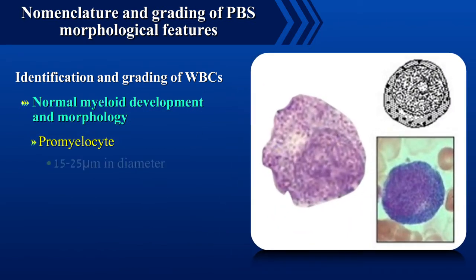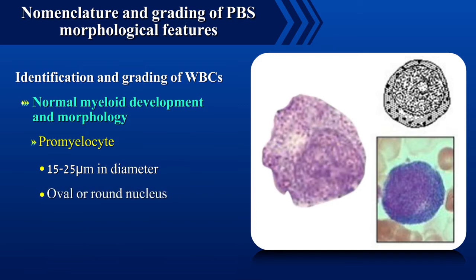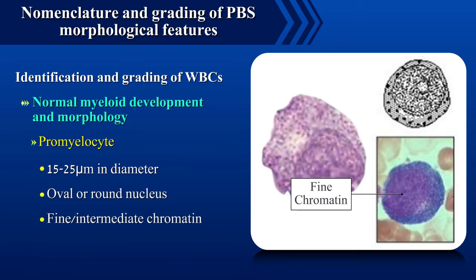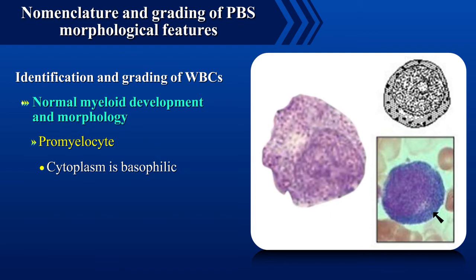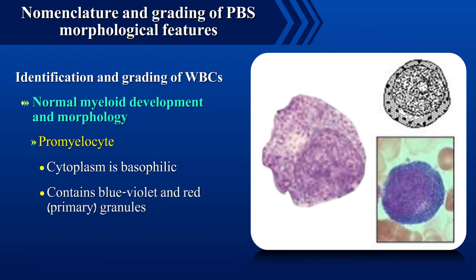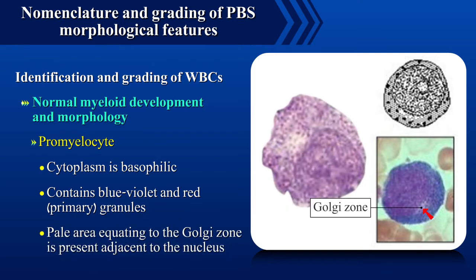Promyelocytes are 15 to 25 microns in diameter, have an oval or round nucleus with fine or intermediate chromatin and a usually visible and prominent nucleolus. The cytoplasm is basophilic and contains blue to violet and red granules. A pale area equating to the Golgi zone is present adjacent to the nucleus.